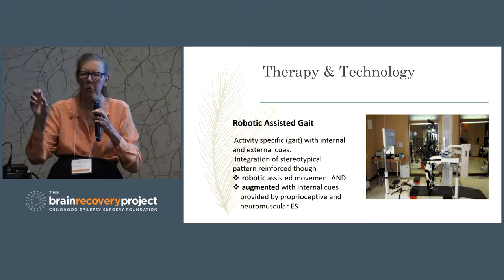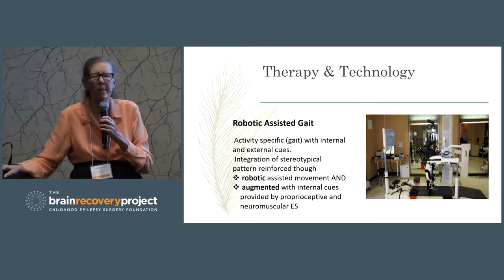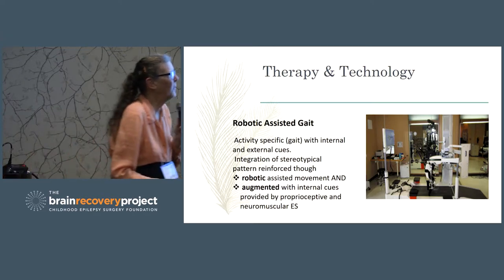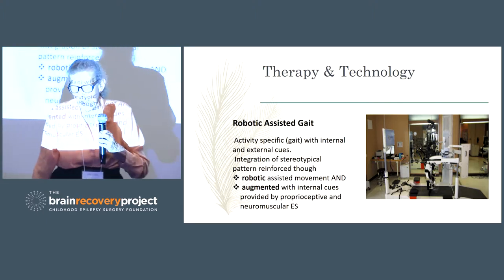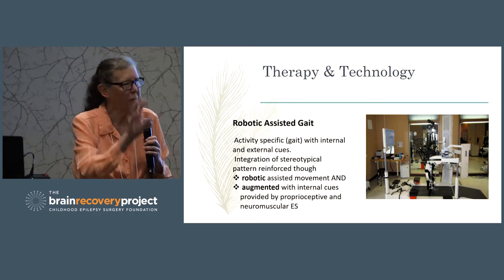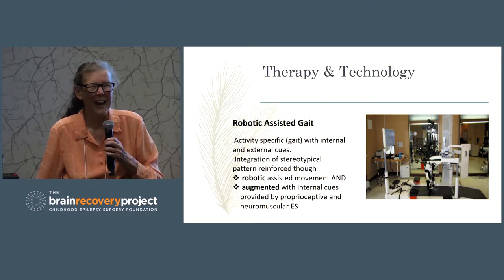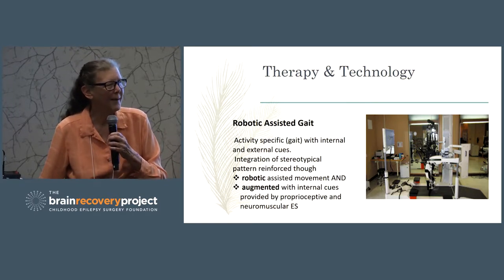We have a quote-unquote robo camp at Rancho every summer for a select group of the hemispherectomy kids. I stepped through a session with one of the kids in this device, the Lokomat. The patient sees the screen, but the therapist has a unit over here, and I watched her watch that. The goal was to increase the dorsiflexion, to get the toe clearance. The patient figured out a way he could get that foot up on the screen without working his dorsiflexors, and she didn't catch it. So she taught him a very effective way to hip hike, and she didn't do what she thought she was going to do.